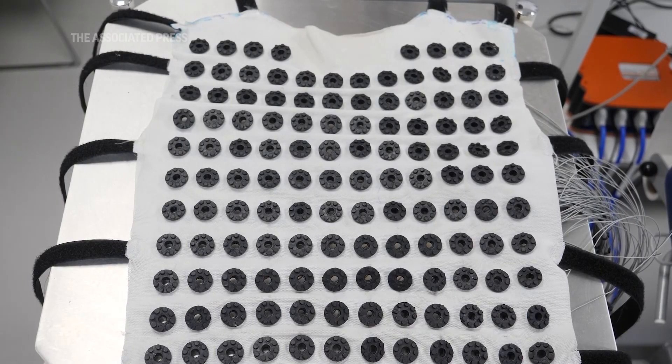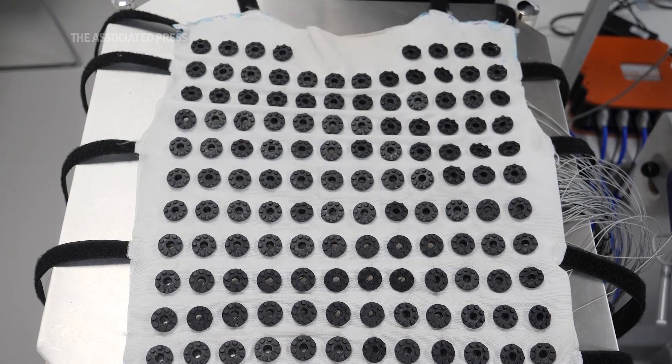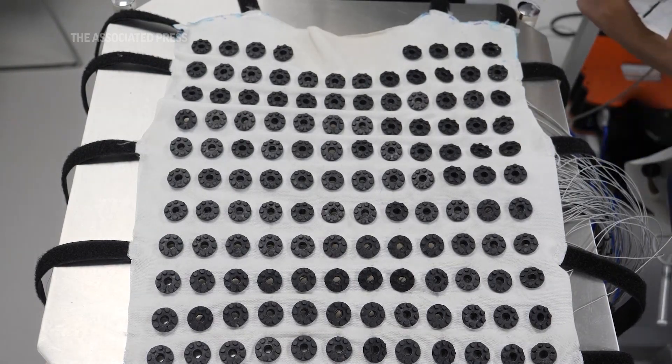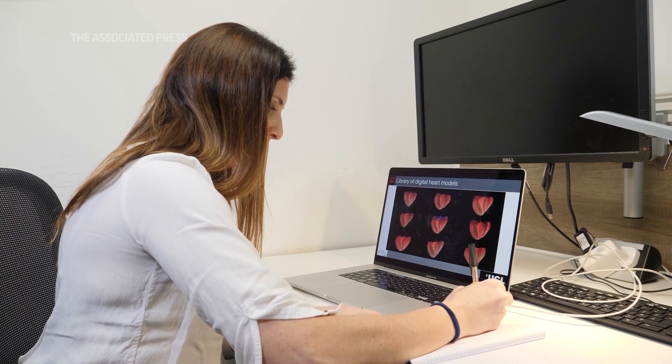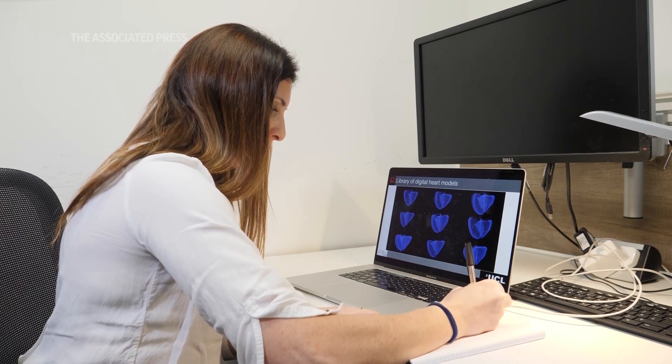What it basically consists of is a vest which a patient can wear for five minutes at rest or during exercise, and it's embedded with 256 sensors which don't have any gel, so they're quite comfortable and easy to wear, and it gives us a huge amount of electrical information mapping the heart.